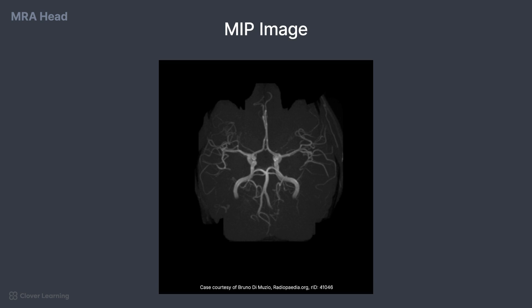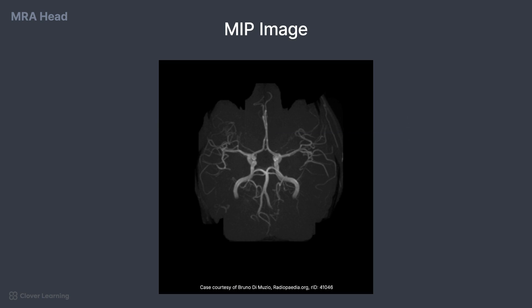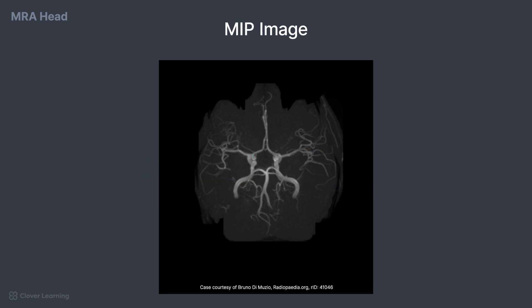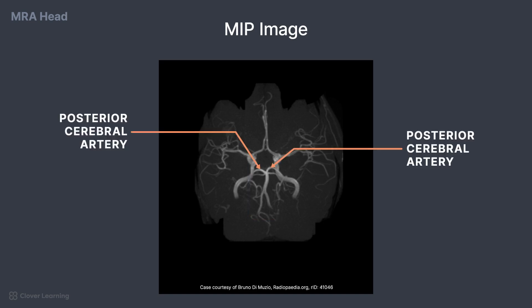On an MRA of the head, one important structure is the anterior cerebral artery. This is easy to identify as it is always in the front or anterior. The internal carotid artery and middle cerebral arteries look a bit like a tree. The internal carotid artery is the trunk of the tree, and the middle cerebral arteries are the branches. One way to look at the posterior circulation of the MRA is like a stick figure with no head. The arms of the stick figure are the right and left posterior cerebral arteries, and the body of the figure is the basilar artery.